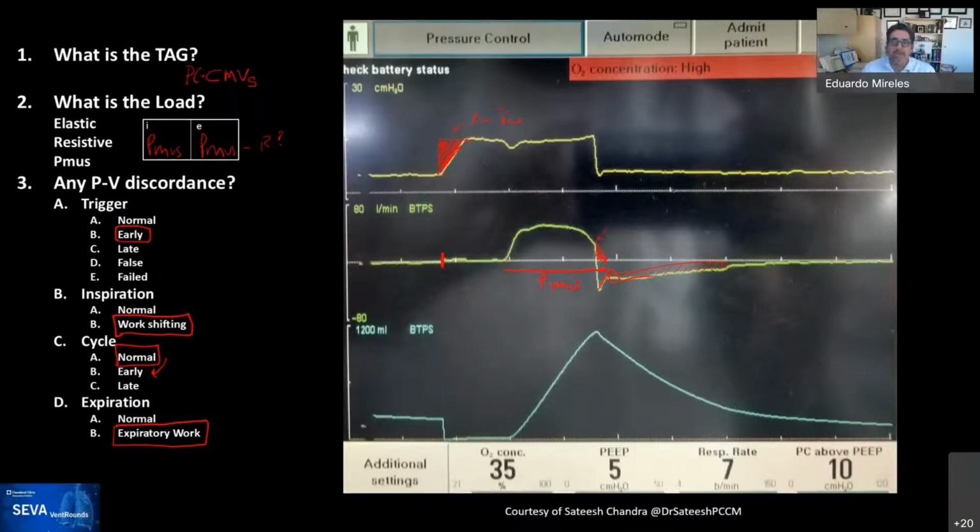And actually, if you ever sit down in front of a ventilator, you're going to see that sometimes we come and bother the patient and he takes a breath in, and it has nothing to do with a reverse trigger, but it happened with the pattern that would be recognized as a reverse trigger. And so I think there's multiple etiologies for this pattern of early trigger, one of which is reverse trigger. The same thing for late cycle. It's not always an issue of we set the I time too long for that patient. There may be other etiologies that cause that pattern that you see.